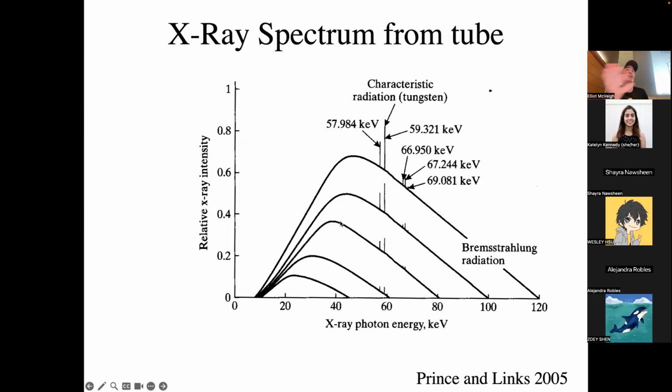I doubt it. Because this is like high energy physics, right? I'm shooting electrons. So I've got an electron collider and I'm shooting it into my target. And depending on how the electron interacts with the nucleus, which is the target, it pushes off these photons, right? A lot of other things can happen.